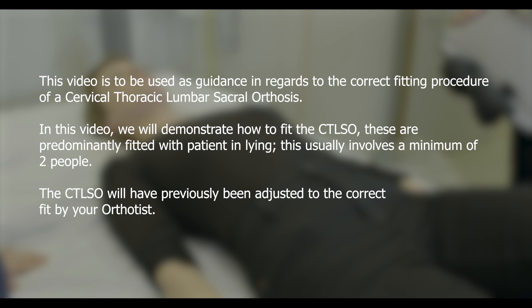These are predominantly fitted with the patient in lying. This usually involves a minimum of two people. The CTLSO will have previously been adjusted to the correct fit by your orthotist.